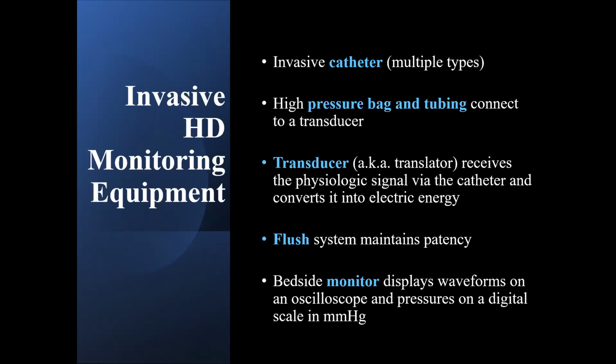The transducer was the thing that was set in the claw. I don't know if Deb Phillips used the phrase claw. The transducer, and I'm digging through my stuff right now so I can show you here. But the transducer is where all the magic occurs, where we level, zero, and keep things as accurate as possible. It allows us to communicate the electrical signal to the monitor.